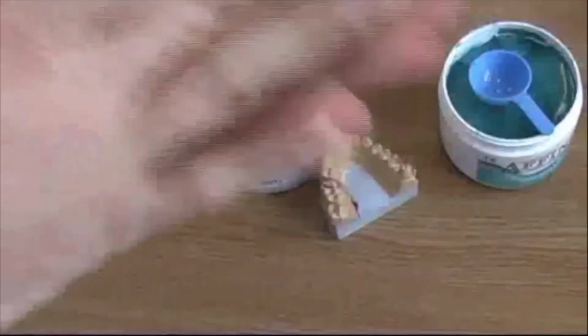And this is how you move it. You make it round and then you press it. Make it ball-like, round, and you press it until you don't see the difference of color anymore between white and color. Until there's only one even color, right?